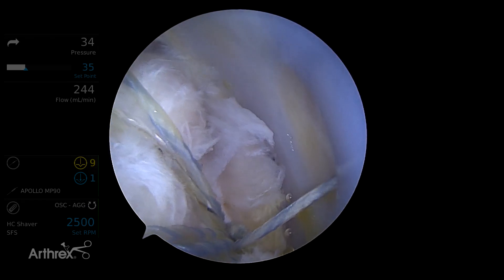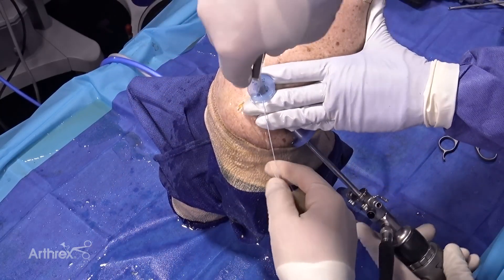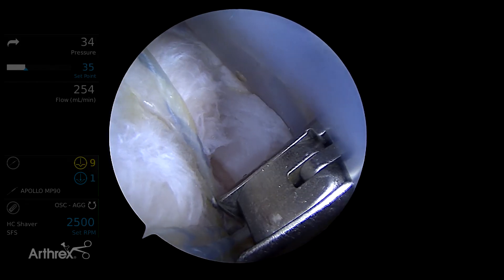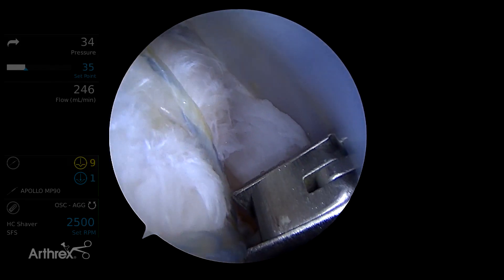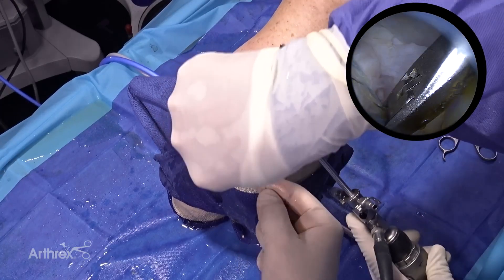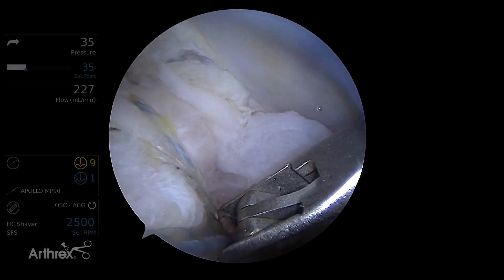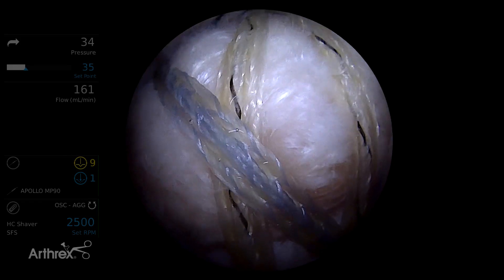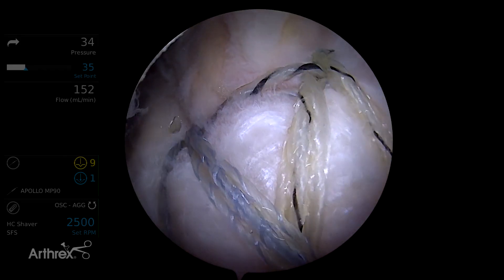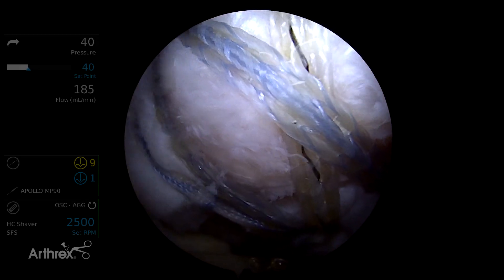Now we'll just cut that off. As we bring this down, if you're not quite sure if you have enough tension to take all the slack out and have enough indentation, we can use this as some counter pressure — just pull as I push with a cutter. Pull a little more. There you go. And now we'll just cut it. So now we can just look at the final result. You see there's such a low profile, totally knotless — looks about perfect.